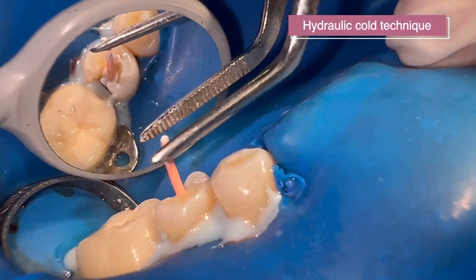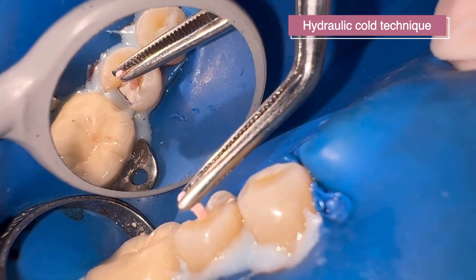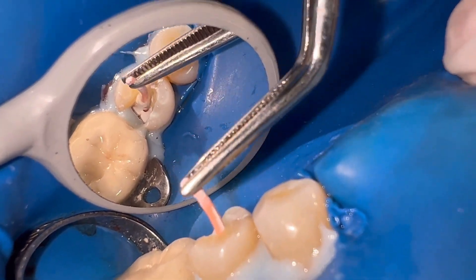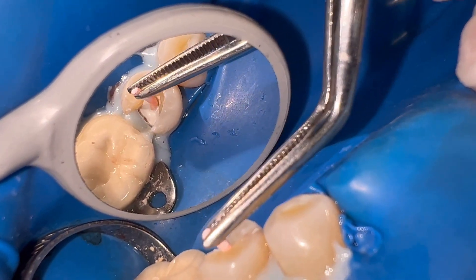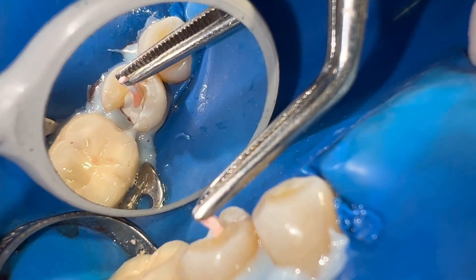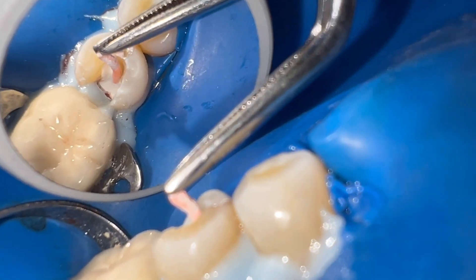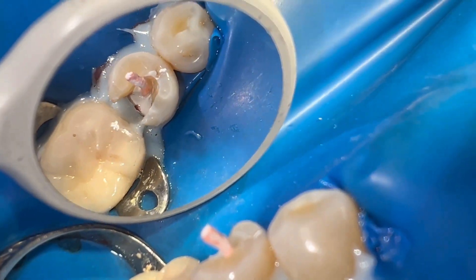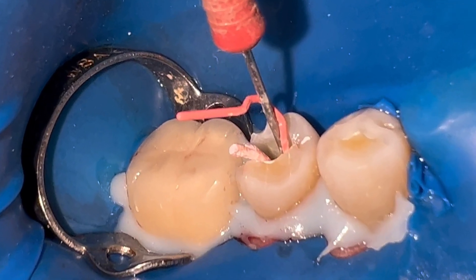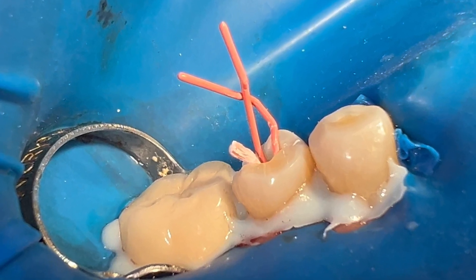We slowly bring our master cone to working length and perform gentle pumping movements. In this single cone technique, I usually perform lateral condensation in large and oval canals, as in this case.